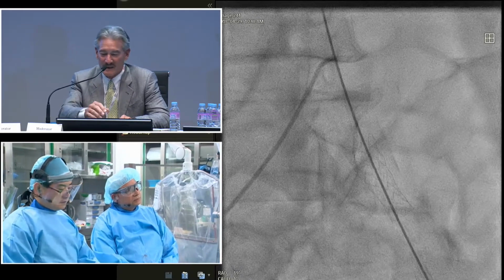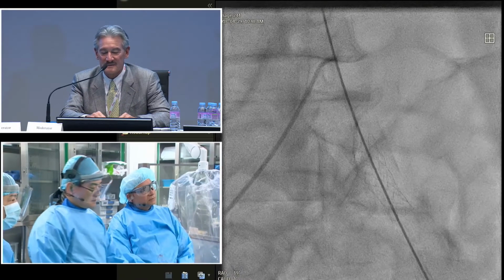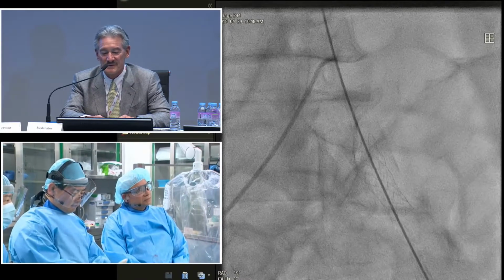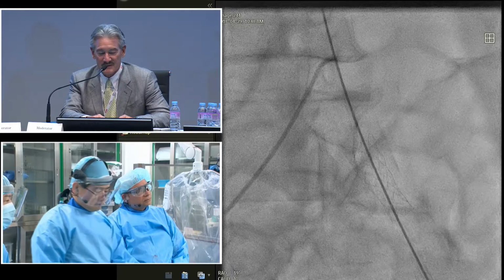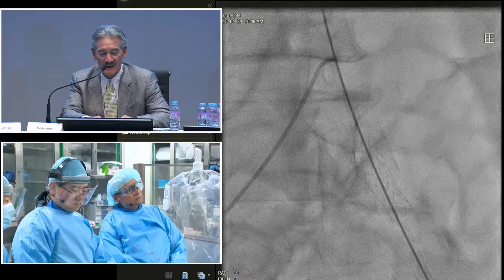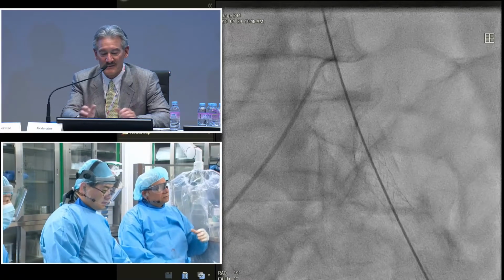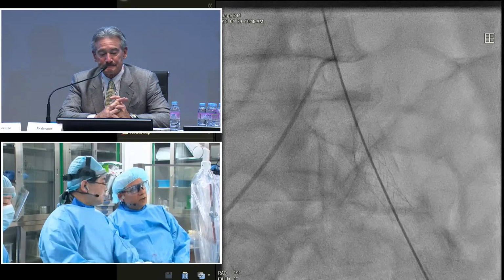That would mean coming down from the brachial approach, and now you have a third access, and it's technically challenging. So I've found it difficult to protect the distal bed in these cases, but often you get away with it anyway. You dilate enough to make room, you put in the covered stent, and a lot of times you're okay. Okay. So most of the time.